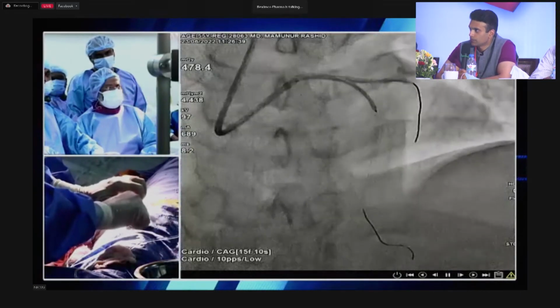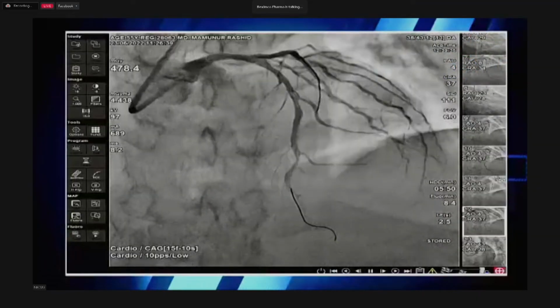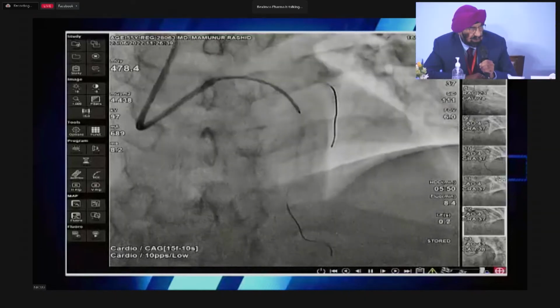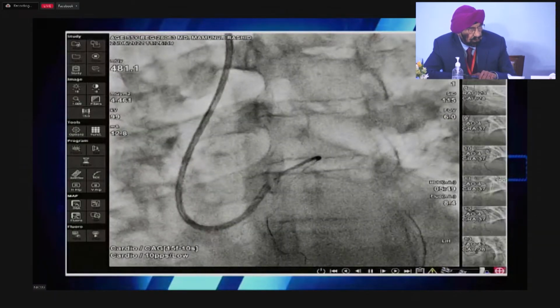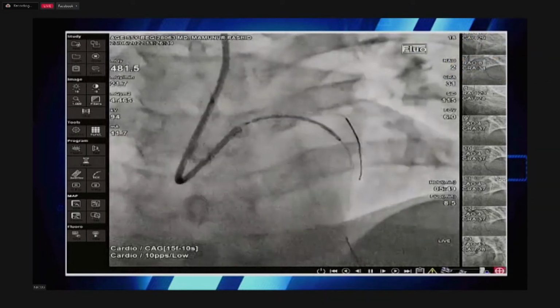This shows the cranial view, and I feel that you are falling onto the disease segment, and in fact, there is significant disease just beyond the distal edge of the stent. Maybe beyond, 1 millimeter distal, you think? Diagonal, we have seen on the IVUS, the lesion is not significant, approximately 30% plaque burden beyond the diagonal.